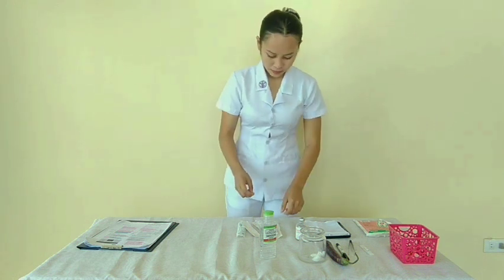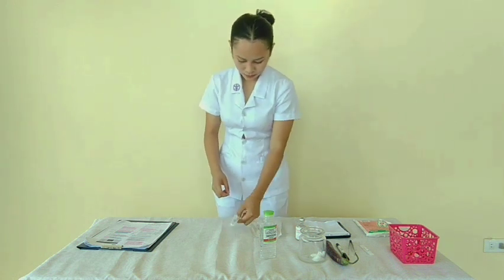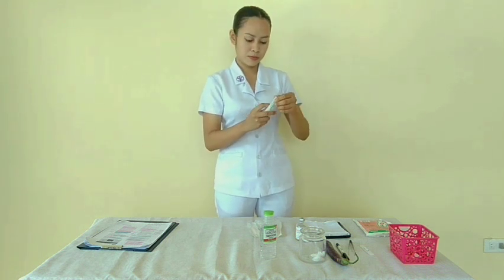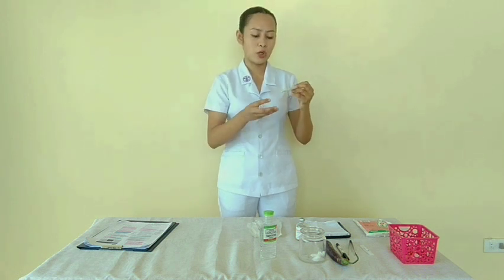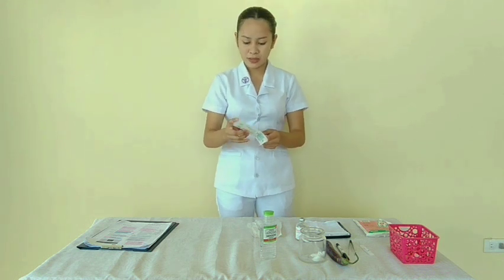And now prepare the syringe and open the package of the syringe. It's also important to remember to only touch the barrel and the plunger of the syringe to avoid contaminating the needle. And since my syringe comes with the needle, I'm going to loosen it up and connect my syringe to my aspirating needle.